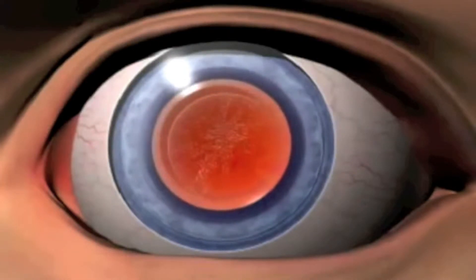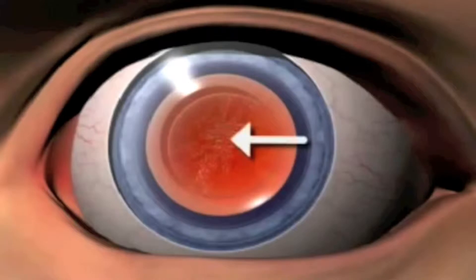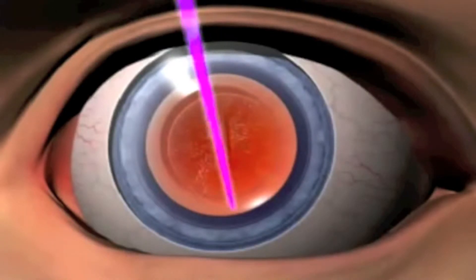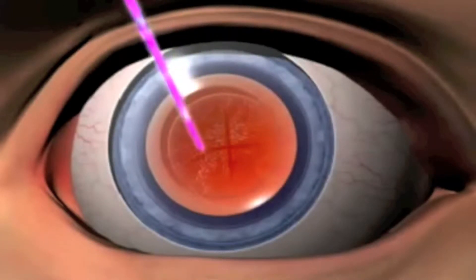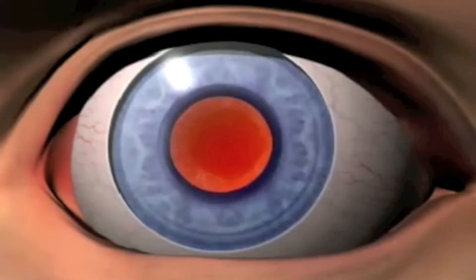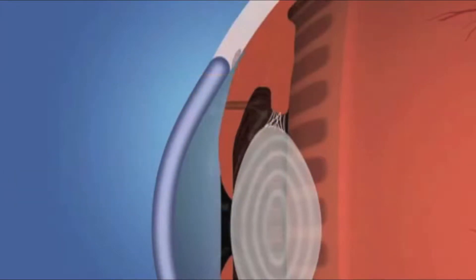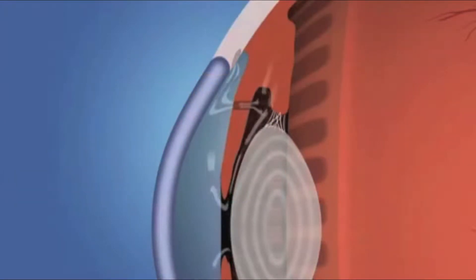This animation will recreate a capsulotomy using a YAG laser. The pupil is dilated to reveal a hazy capsule lying behind the intraocular lens, as shown by the pointer. The laser is applied in a specific sequence that clears the central visual axis. This is a painless procedure. A peripheral iridotomy uses a YAG laser to create a tunnel or passage through the iris. This hole will restore normal flow of fluid in a narrow-angled eye.